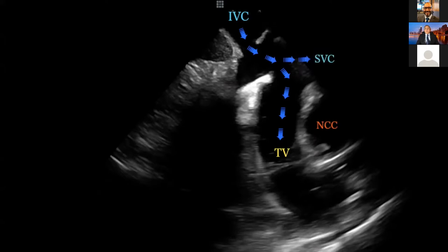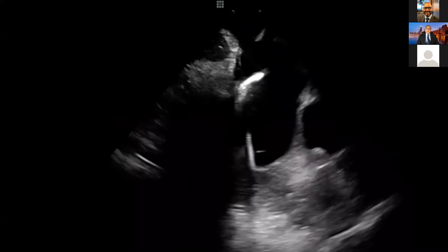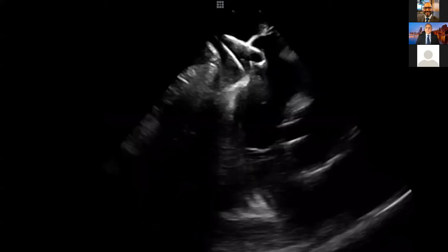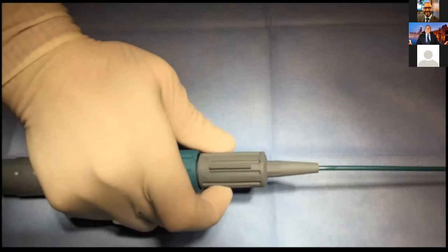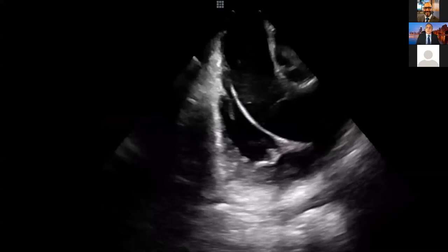That's the non-coronary cusp, or you can go towards the SVC. That's why sometimes your catheter doesn't want to go to the right atrium — you can see how small that orifice is. If I add color, you can appreciate the jet. That is the CS catheter, the decapolar catheter. I pulled back the ICE to see that orifice to be able to manipulate, then advanced the J wire towards the SVC because I'm going to do a transseptal puncture. I had to keep doing clockwise and counter-clockwise, a little bit anterior to posterior, to manipulate through that orifice, and ultimately came to the right atrium.